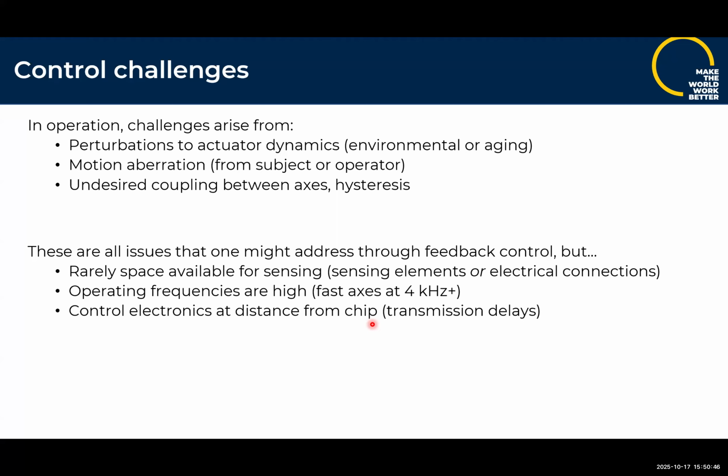We also are trying to drive these usually in multiple axes at once. And that analysis was one axis at a time. Most of the time, our analyses are one axis at a time. But once you get multiple axes moving, most devices end up coupling together in better or worse sorts of ways. And that introduces more challenges for control. More reasons you might want to have control.